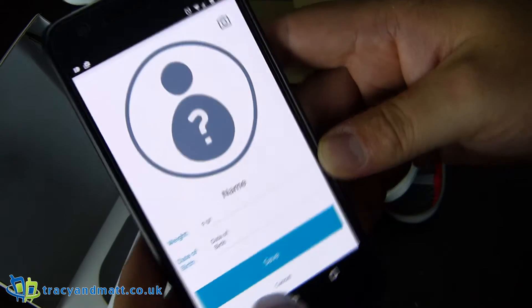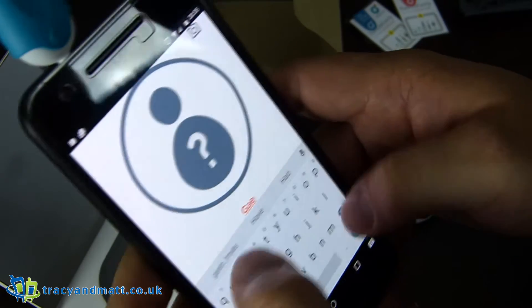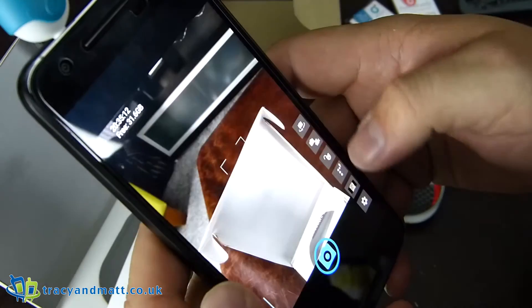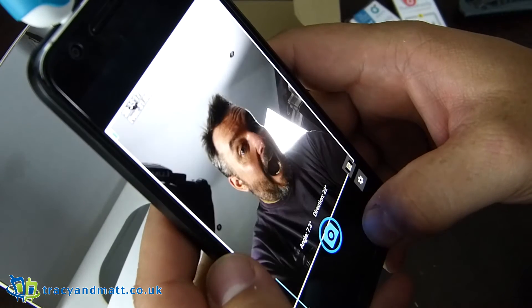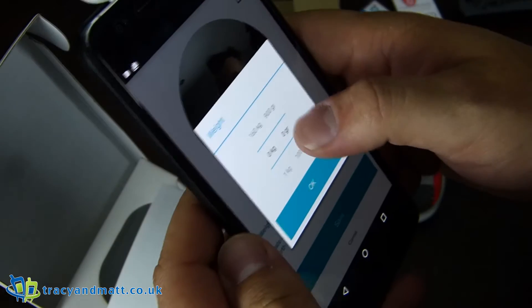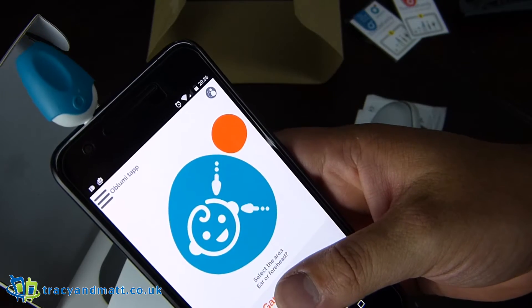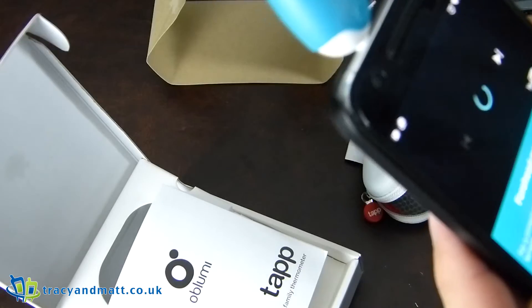So we'll create a patient. Weight, name — Gareth. Here we have my name and personal details. And I'm going to select ear or forehead — forehead measurement.